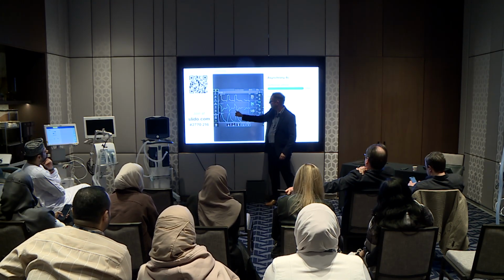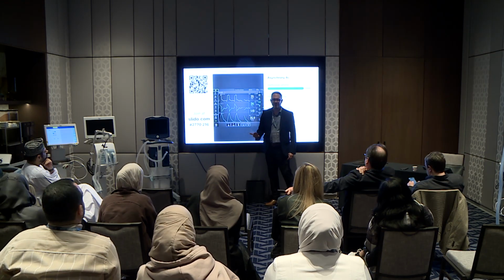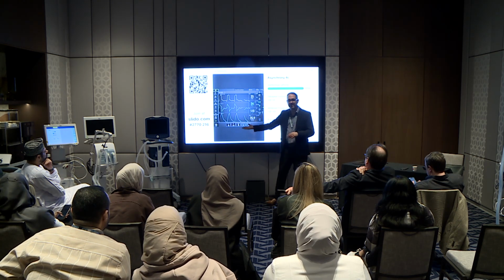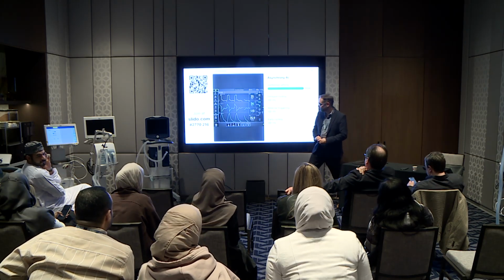So clearly the patient wants to breathe here, here, here. If I look at the effort here and here, my IE ratio is like a 1-to-1 ratio. So I could reduce cycling, but I would much rather you decrease the pressure support, which is 20, which is very high. But I cannot control cycling in pressure support. Yes, you can. How?